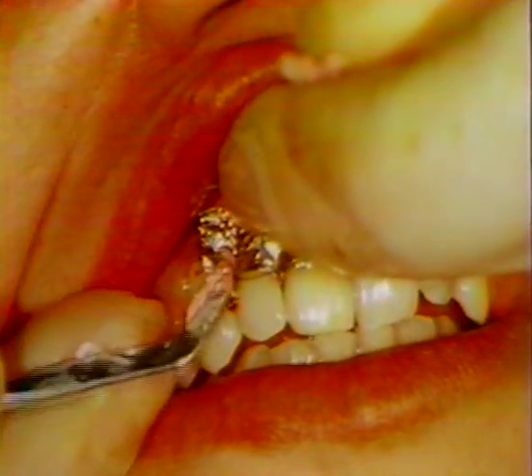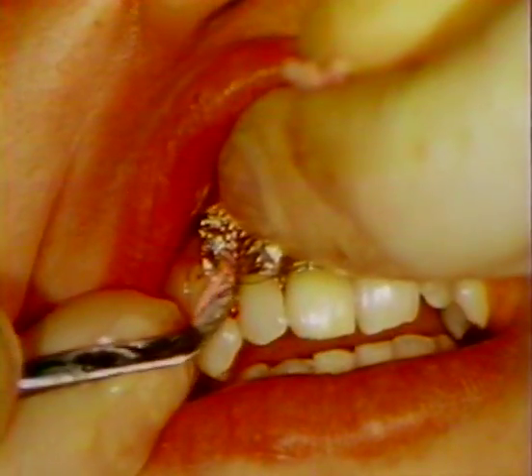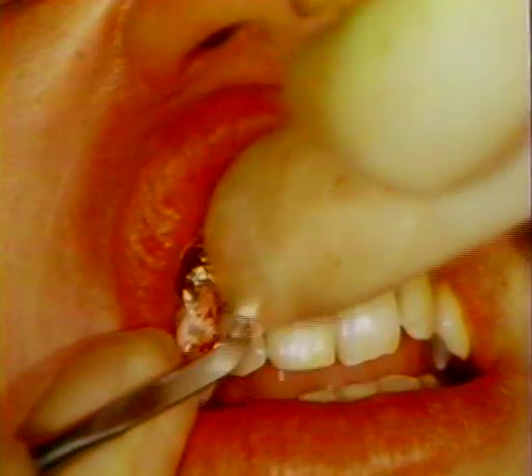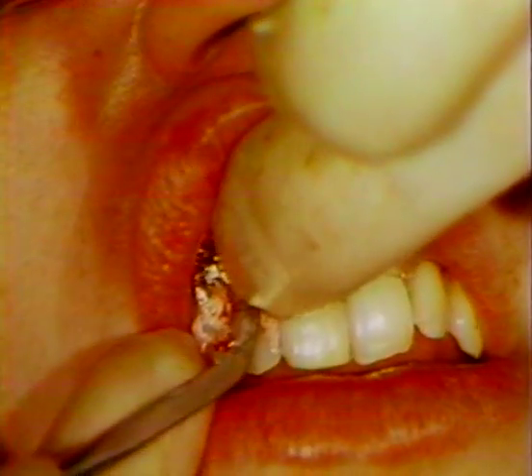A periodontal dressing is placed into the interproximal area to hold the dressing in place. It will also hold the flap and tinfoil in a well-adapted position.